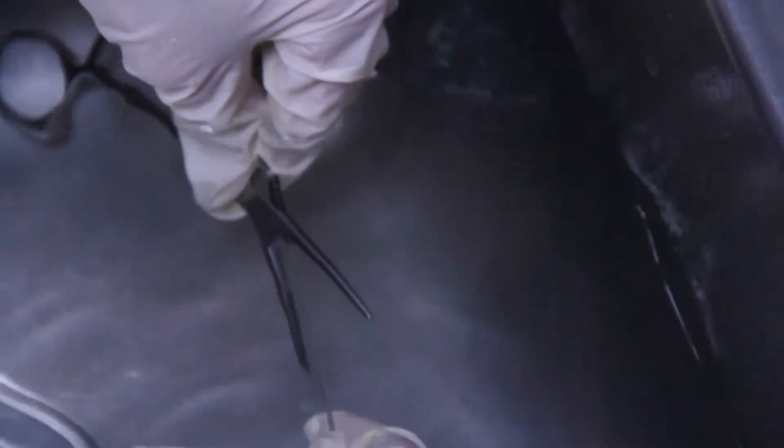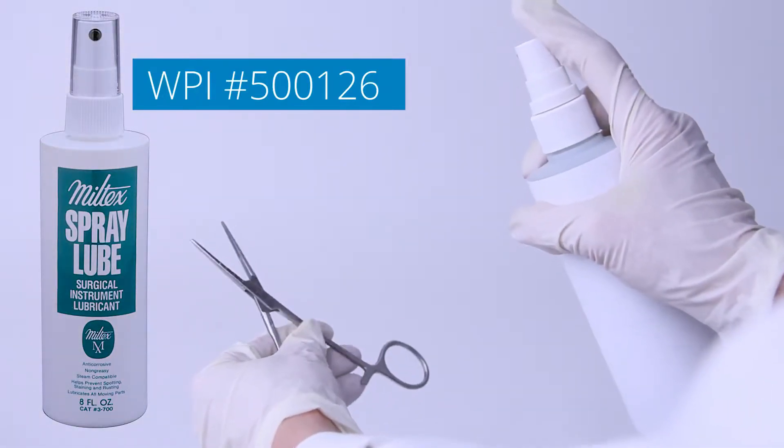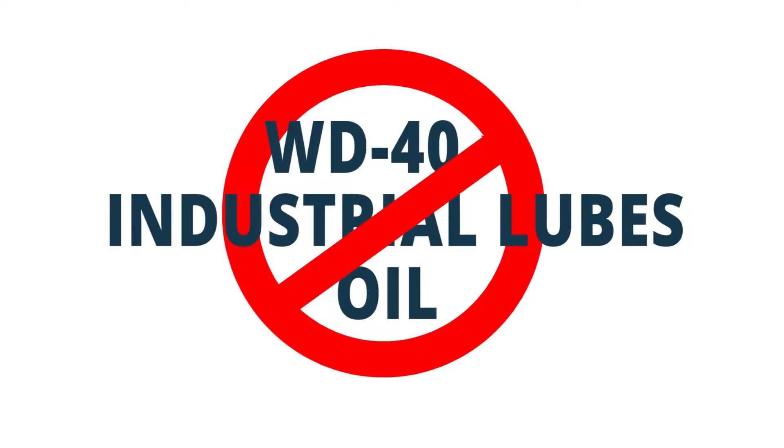Prior to sterilization, clean the instrument and lubricate all hinged instruments with a surgical instrument lubricant. Do not use WD-40 oil or other industrial lubricants.